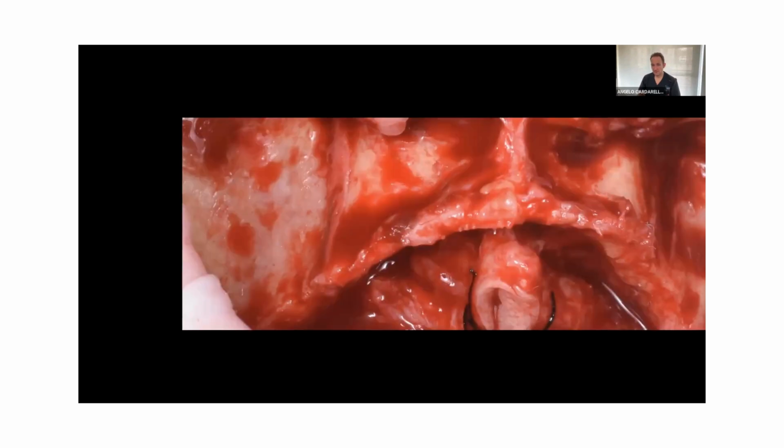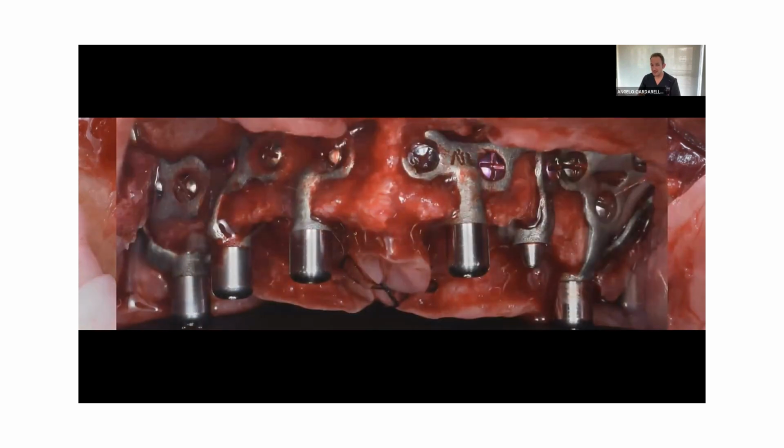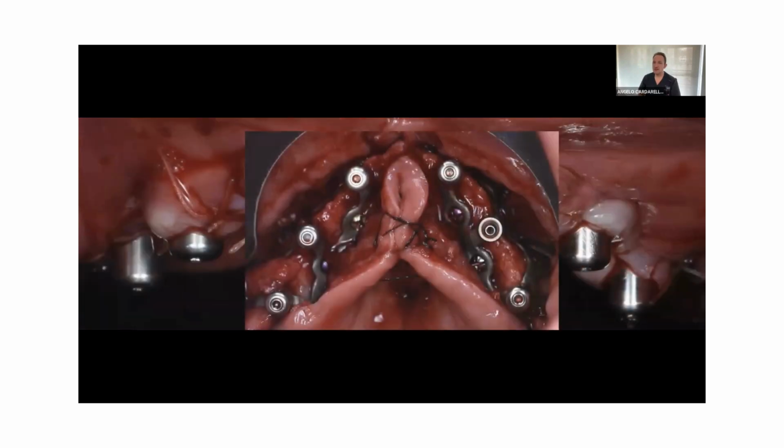But have a look at the CBCT. That's amazing. No gap. Perfect filling. Again, this is the proof of the precision of this framework. The titanium framework is perfect in terms of the fitting. This is the case. You can see that we don't have bone. Nasal cavity, can you see? And have a look also, the palatal view is perfect. The fitting, again, is perfect. Okay?